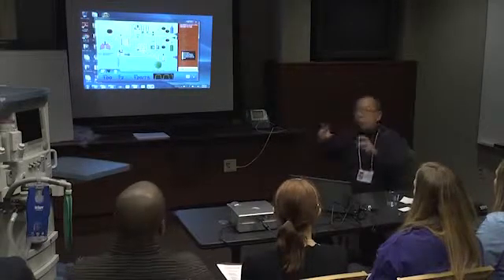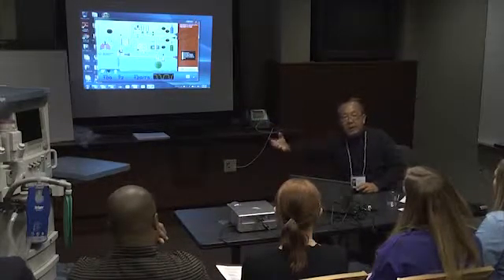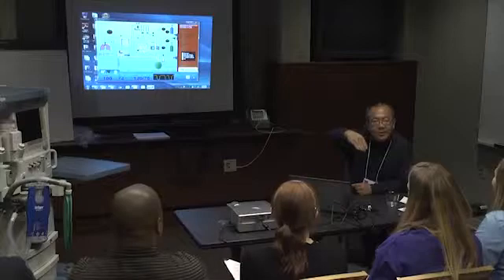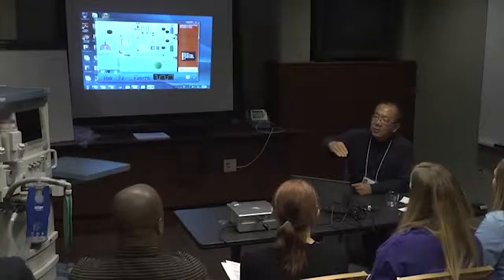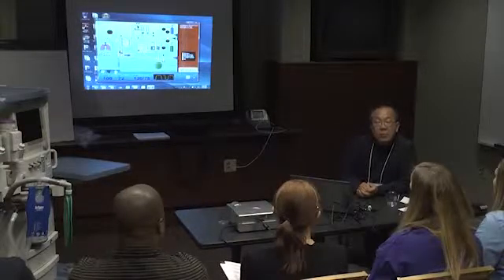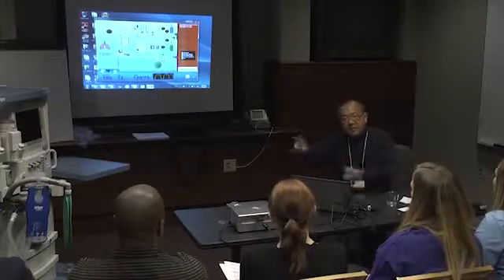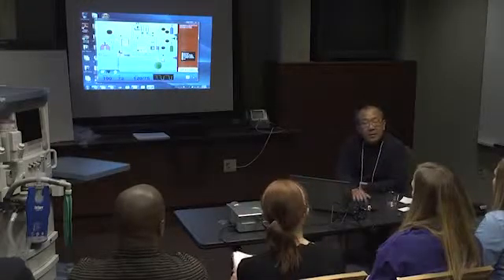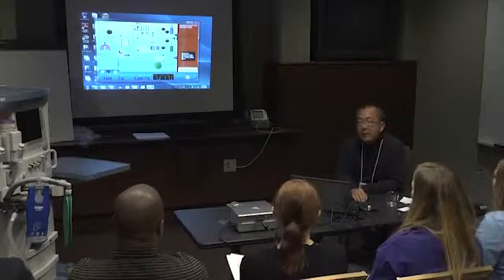Although it may look like you have a wall outlet in your operating room, really behind the wall there's a closet with somebody in there. He's looking at the gauge when the OR is running, and when the gauge on the H goes to 200, he opens a new H and closes the old H. What happens is that the new cylinder has been misfilled at the factory. Even there he can't misconnect it because the threads are different. But in the case that really happened, it happened at the factory. It was misfilled with argon, and the patient died.